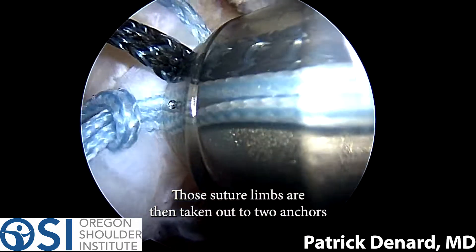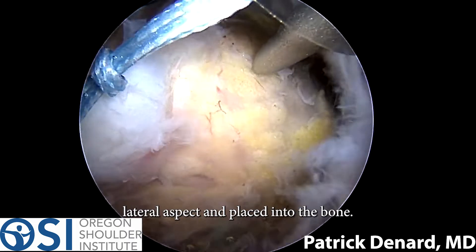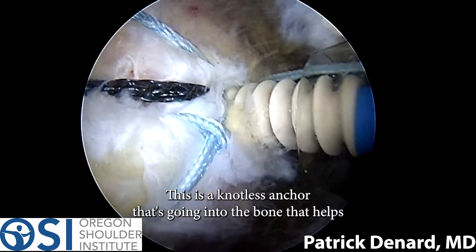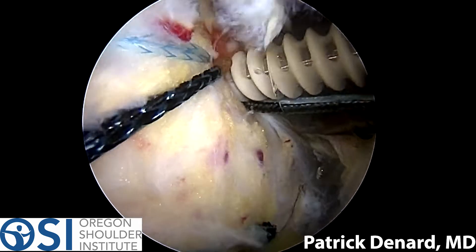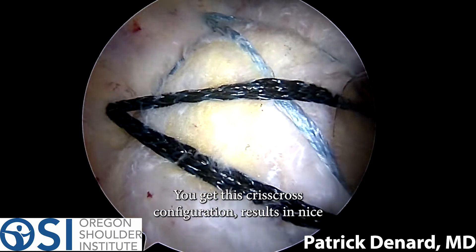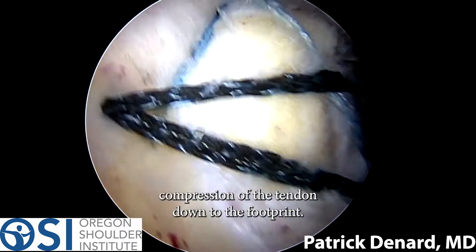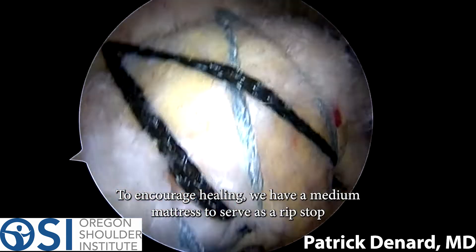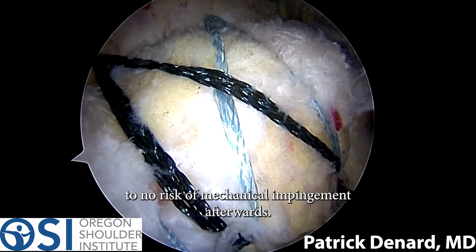Those suture limbs are then taken out to two anchors on the lateral aspect and placed into the bone. This is a knotless anchor going into the bone that helps get fixation between the sutures and the anchor. We'll repeat that in the front, so we have a total of four anchors. You get this crisscross configuration, which results in nice compression of the tendon down to the footprint to encourage healing. We have a medial mattress to serve as a ripstop, and it's knotless and low profile — so minimal to no risk of mechanical impingement afterwards.